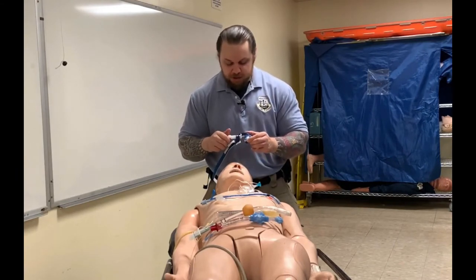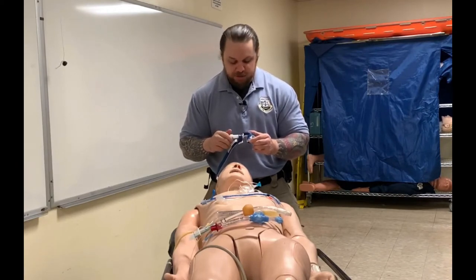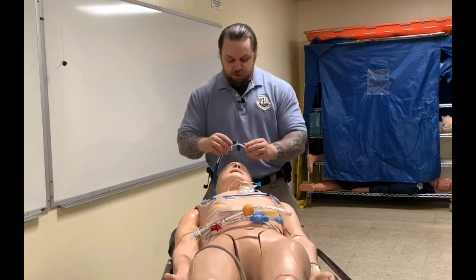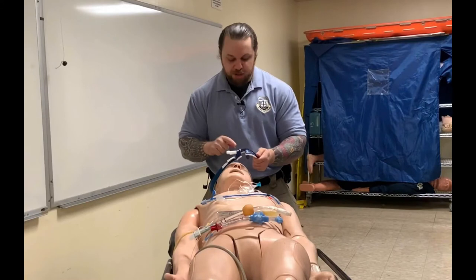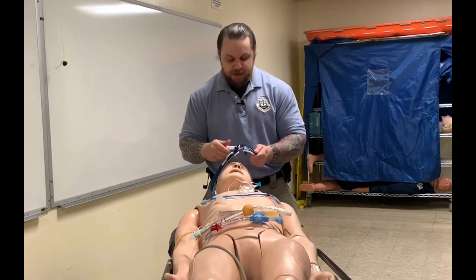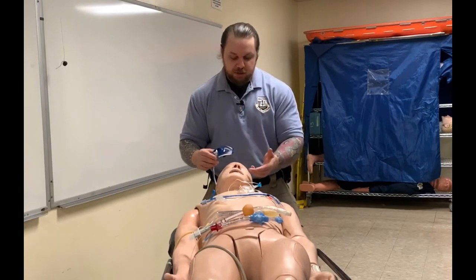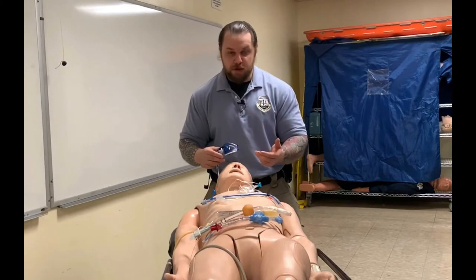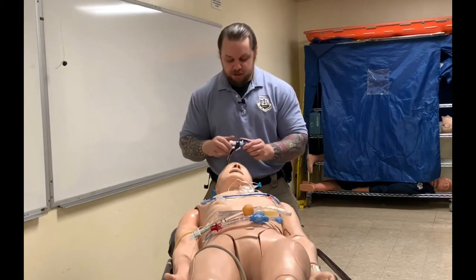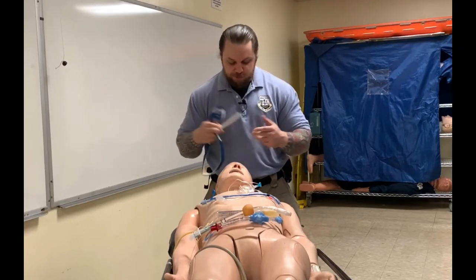The last part is this screw clamp, and the screw clamp is always the last piece to be adjusted. If you place it inappropriately — putting the screw in first while it's holding the tube — and then try to adjust the velcro around the patient's head, you will pull the tube and potentially dislodge it or move it from the proper position. So the screw clamp is always adjusted last.